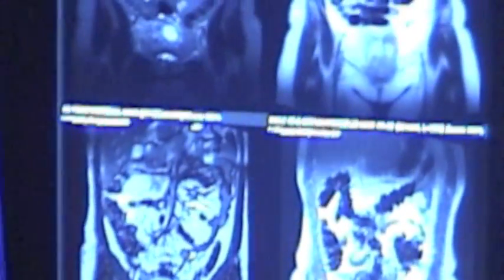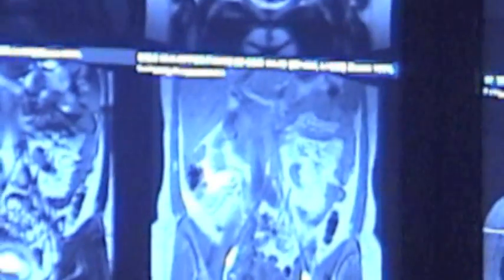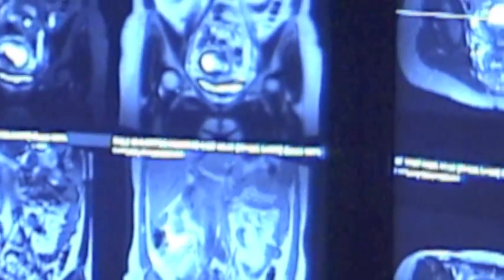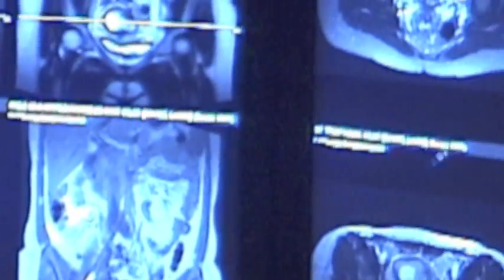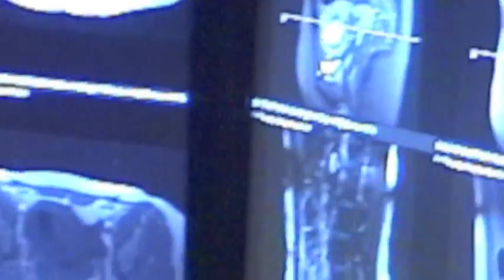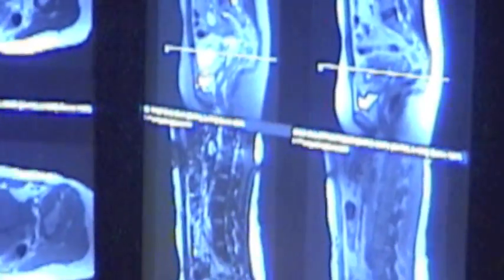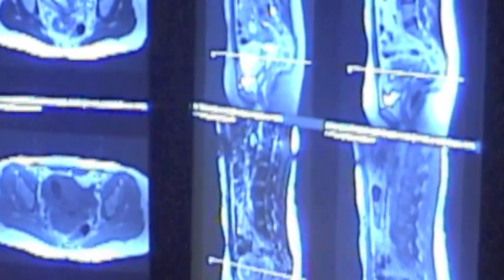Confirmatory evidence comes from the diffusion images — there is no large bright signal in the right lower quadrant. There is a bright signal here which we'll chase to make sure it's not the appendix. Once I've reviewed the coronal Haste IRs and don't see any bright fluid collections around the cecum, I know the study is likely negative for appendicitis. I try to find the appendix in the coronal; if I can't, I'll come back through the sagittals or axials to find it and say definitively it's negative.